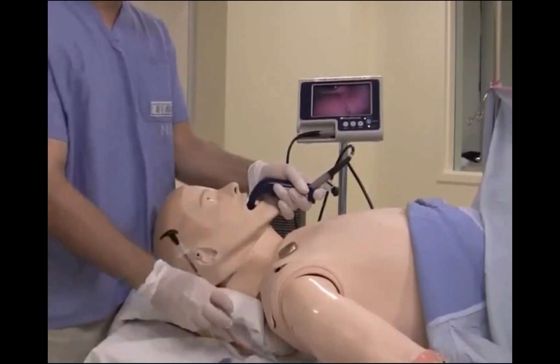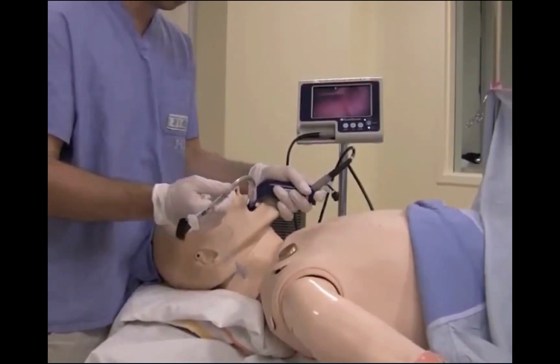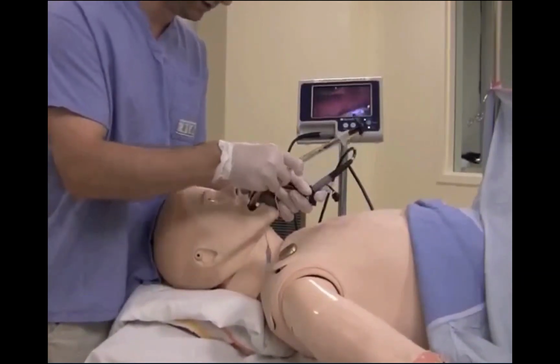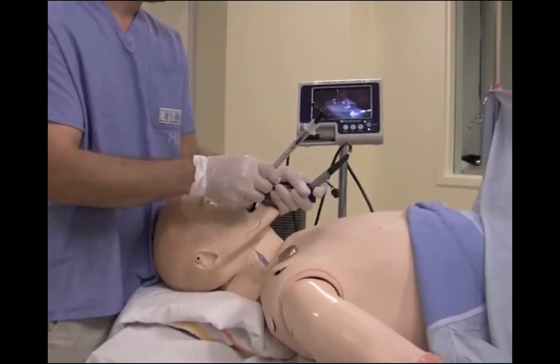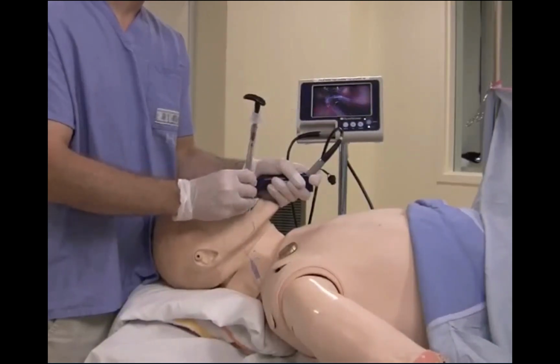I then will introduce my endotracheal tube, again under direct vision, looking inside the mouth to avoid dental damage as well as navigating around the tongue. Once I am firmly inside the mouth, I can then look at the screen and aim my endotracheal tube for the glottis.